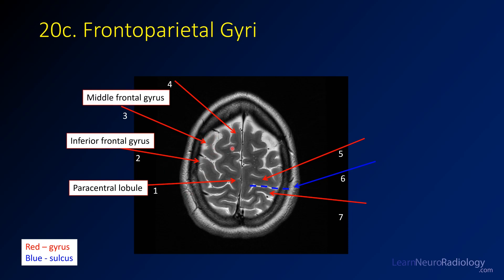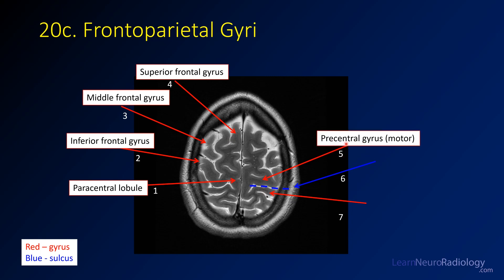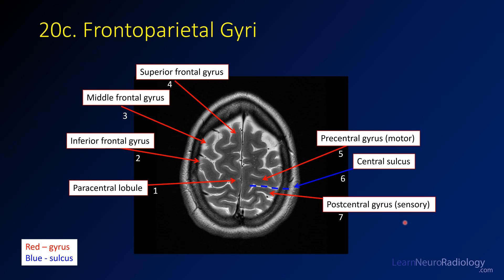Here you have the middle frontal gyrus, and here you have the superior frontal gyrus — the same ones you see on the coronal image but shown on the axial image. Number five is the precentral gyrus, which is the motor cortex. This is the central sulcus, which divides the precentral gyrus from the postcentral gyrus — your primary sensory cortex.